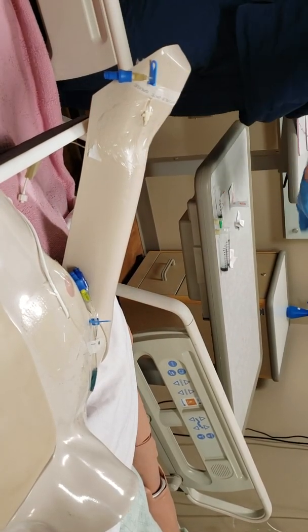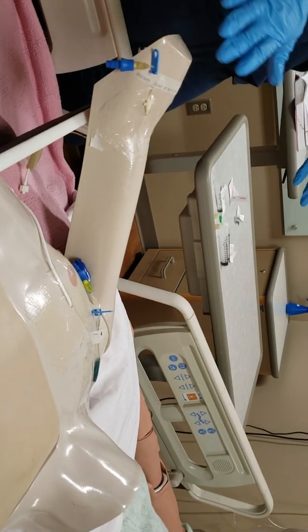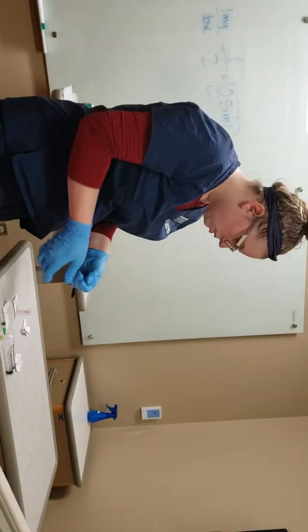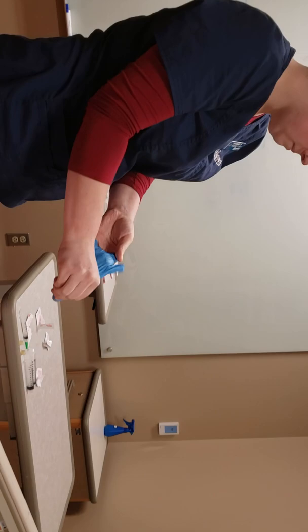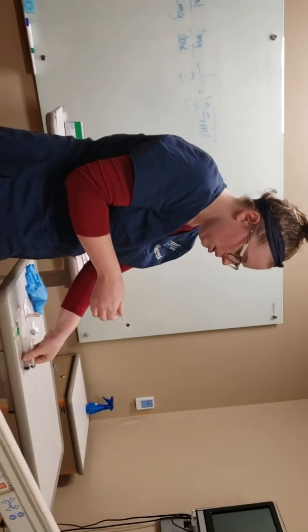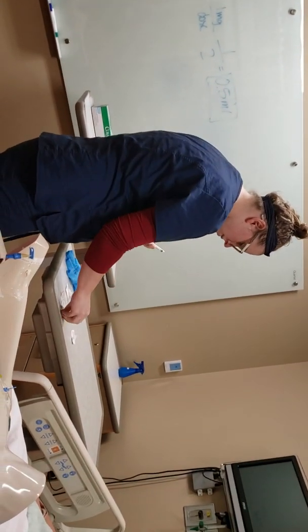Okay. Mary, how are you feeling? She says she feels okay. There is no change in respiration or anything at this time. So I'm going to remove my gloves. I'm going to clean up my drugs, dispose of my vials.